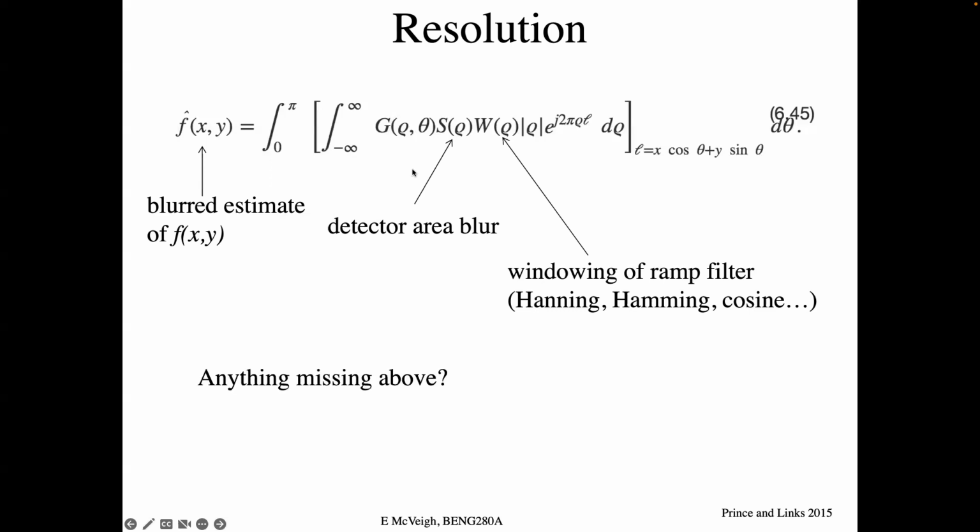So those are the primary components. Oh, there is one missing out of this analysis. He does it in the book, but under X-ray imaging, not CT. And that's the X-ray spot size. So it also depends on how large is the rectangle from which the X-rays are coming, like from the tube. So they don't come from an infinitesimal spot. They come from a rectangle on the target.